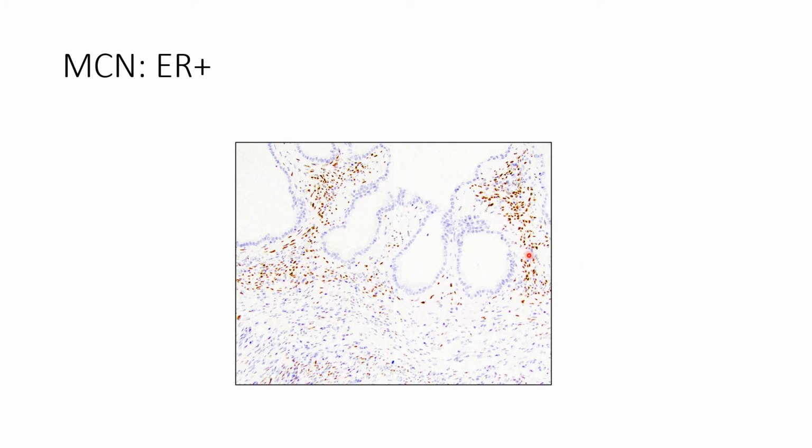And MCN is strongly positive for ER, estrogen receptor. Here you can see the brown nuclear staining with ER.